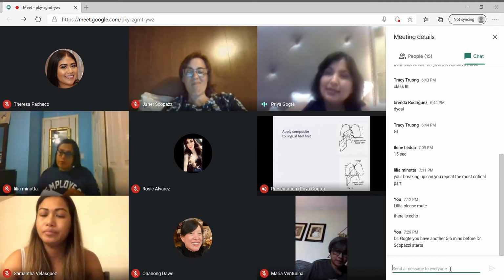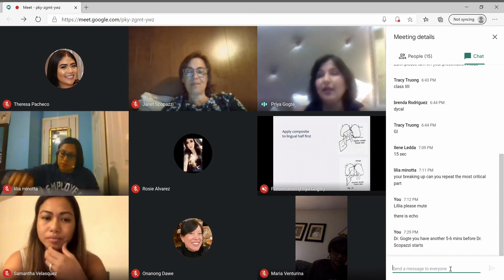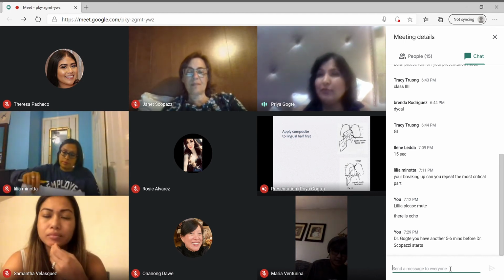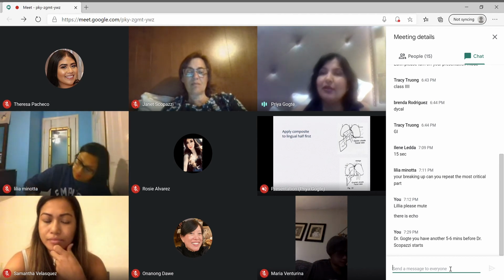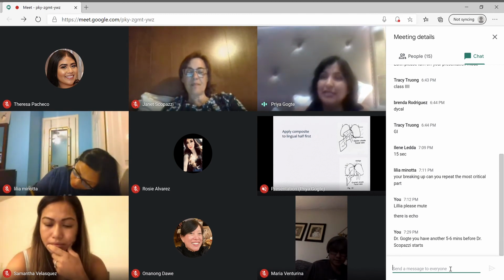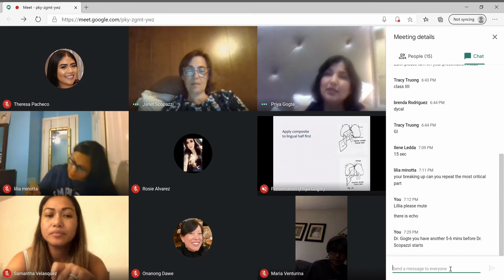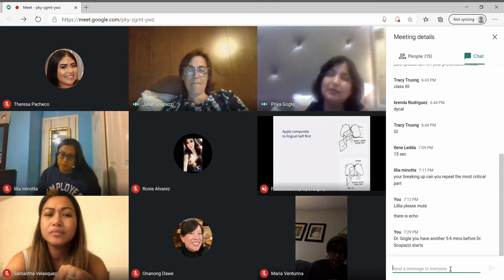And at the incisal edge, if you want, you can put the translucent shade again. Just don't put too much translucent, because translucent shades start giving a gray look. The best is that the regular dentine shades are very forgiving and they're opaque, so they work pretty well. If you are in doubt, just use that.